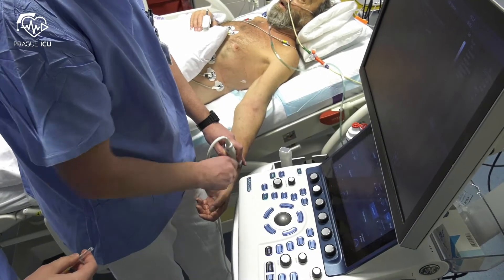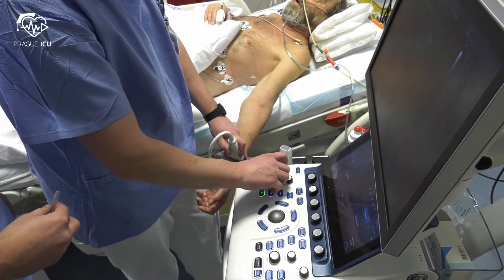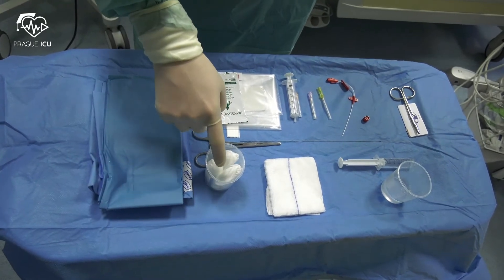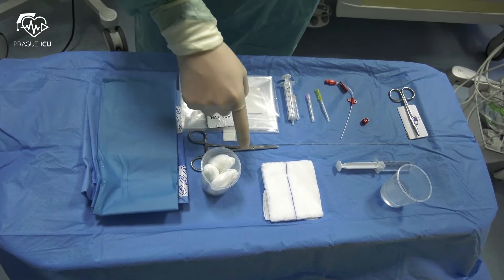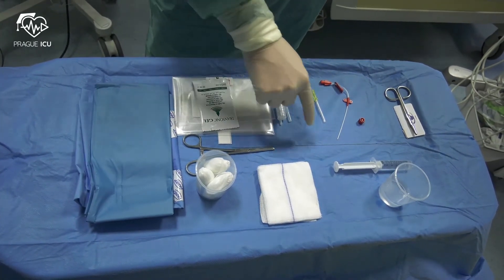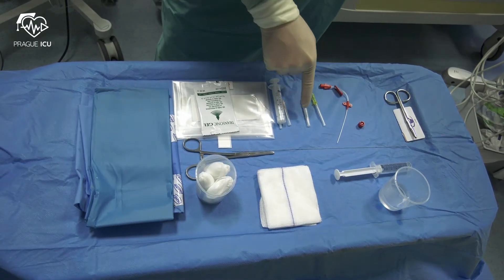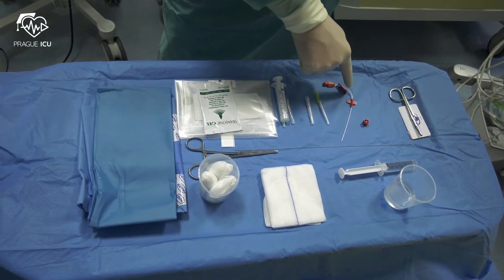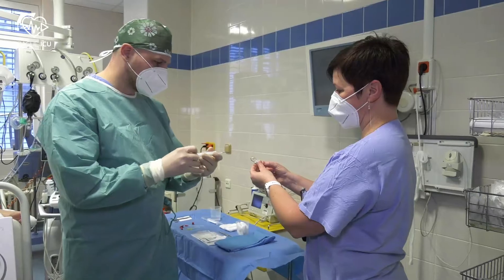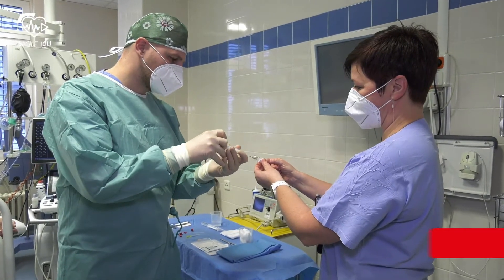First, briefly check the patency and diameter of the radial artery by ultrasound. Set up a sterile trolley. You will need sterile draping, swabs for disinfection, a clamp, a sterile cover for the ultrasound probe with sterile jelly, a syringe with a thin needle for local anesthesia and another syringe for flushing, an arterial catheter, and some suturing material. Prepare an anesthetic such as trimecaine or lidocaine.